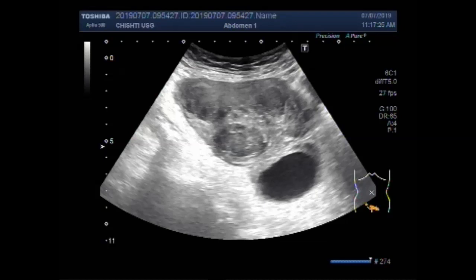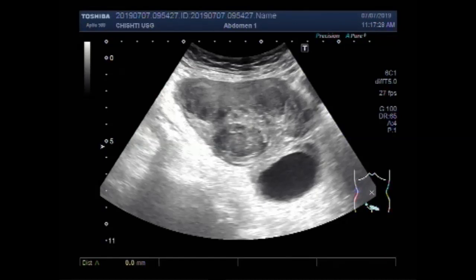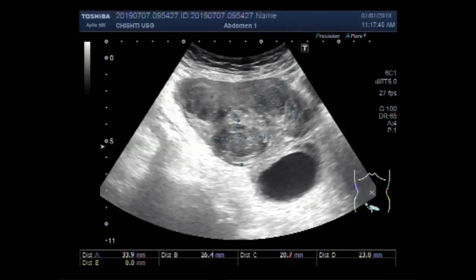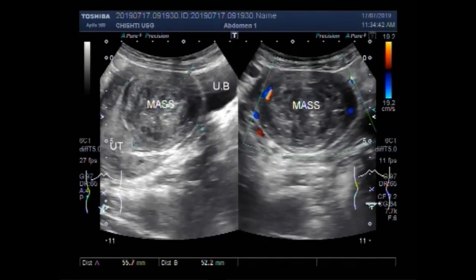You can see the measurement of these masses. This mass measures about 3.4 cm by 2.6 cm, and this mass measures about 2.1 cm by 2.3 cm. This mass in the distal portion of the uterus measures about 2.8 cm by 2.5 cm. You can see that nearly the whole of the uterus is involved.